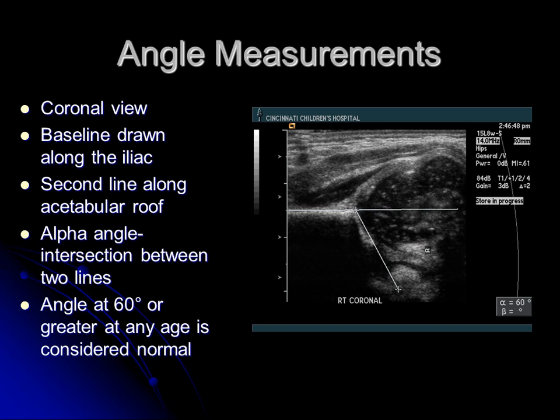Angle measurements are done on the coronal view. A baseline is drawn along the iliac, and then a second line is drawn along the acetabular roof. That angle is called the alpha angle, and it should be 60 degrees or greater if normal. This is kind of like the opposite angle to the acetabular angle we do on plain films, where you use a line connecting the tri-radiant cartilage and measure the angle of the acetabulum in relation to that — we're looking at the same thing, just in a different way.